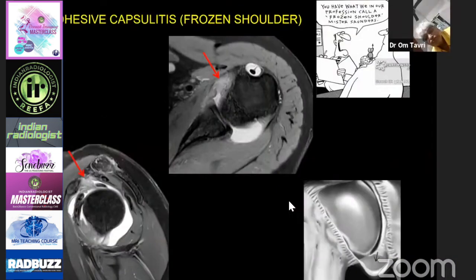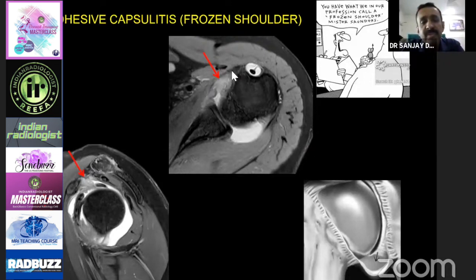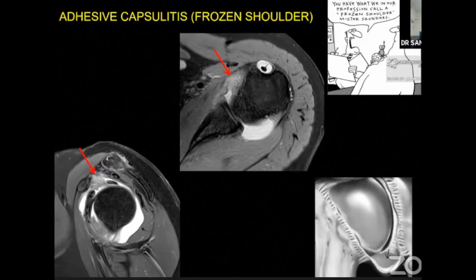Adhesive capsulitis is almost always mistaken for rotator cuff tears, which is why I include this. The findings of adhesive capsulitis are: thickened and bright anterior inferior joint capsule, and dirty-looking soft tissue in the rotator cuff interval. If you find either of these two findings, you can give a diagnosis of adhesive capsulitis.